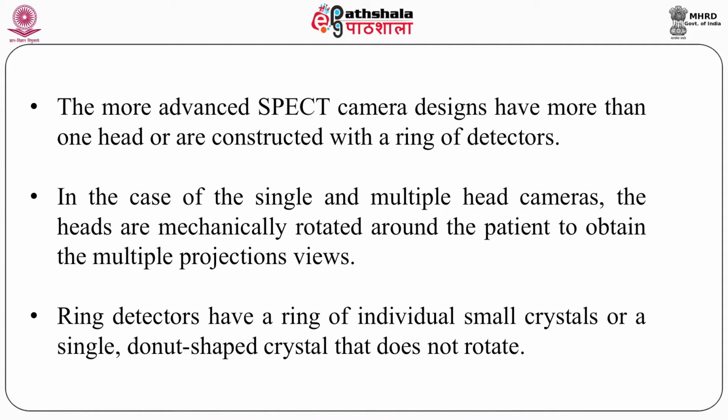Ring detectors have a ring of individual small crystals or a single donut shaped crystal that does not rotate. What do you mean by ring detectors? It means the detectors are not rotating. They are in the form of a ring. Detectors are all around the patient.